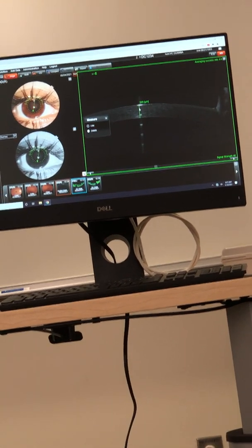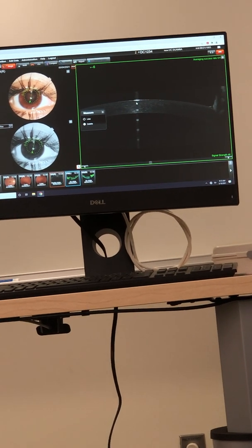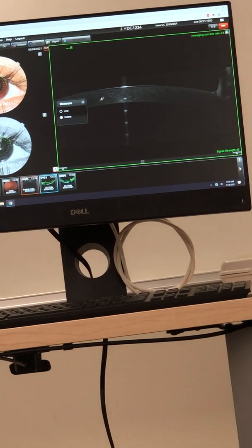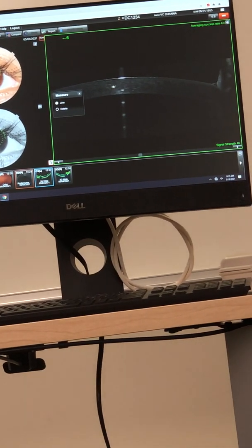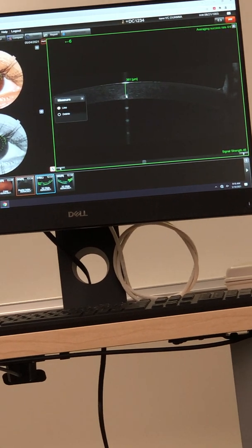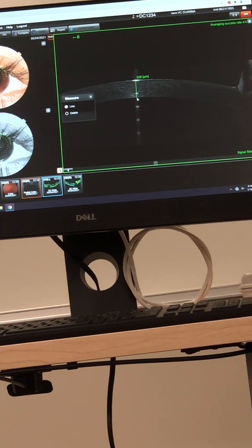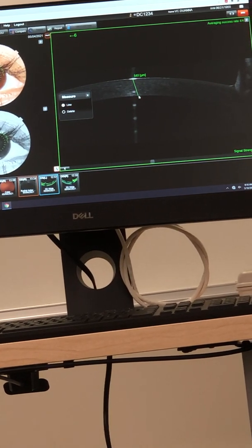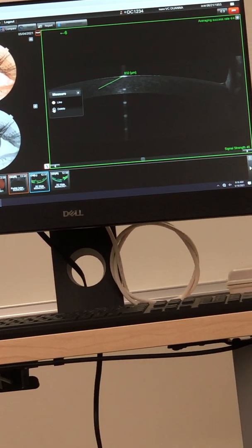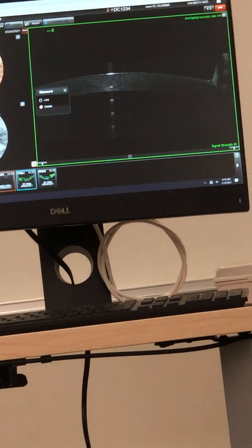Well, it's important that you make this at 90 degrees, perpendicular right there, because it will vary a little bit, as you know. You just gotta start too low here, but obviously, the more angle you go, the longer it's gonna be. Okay.